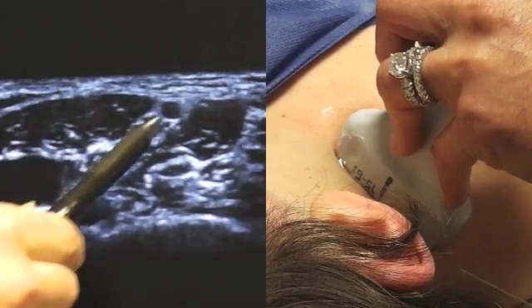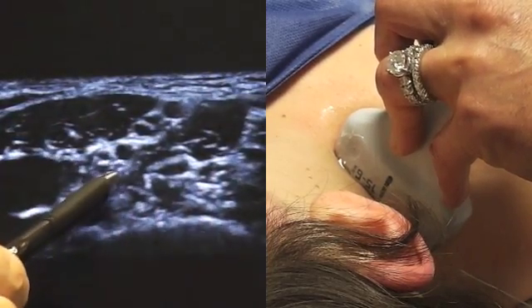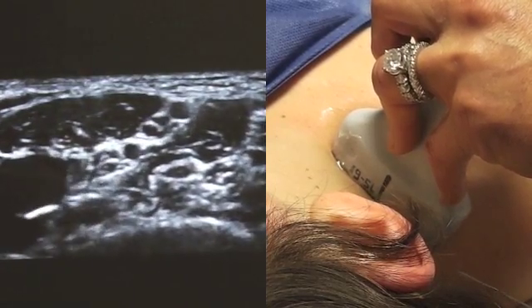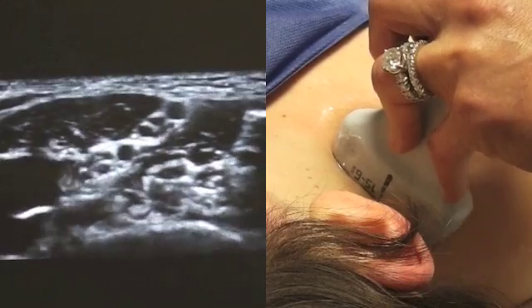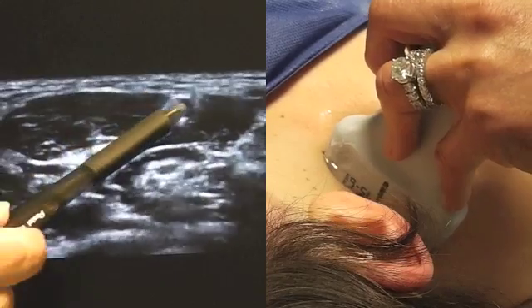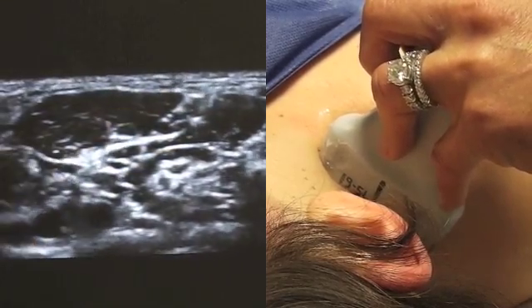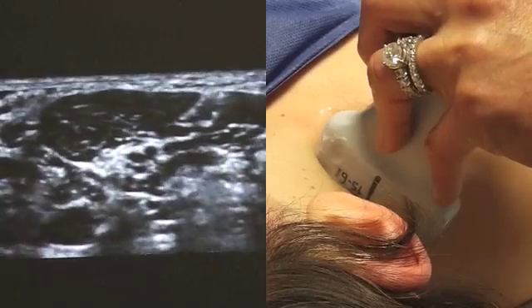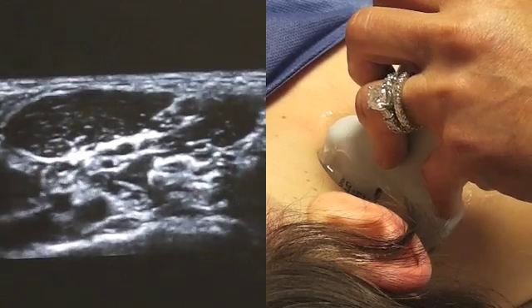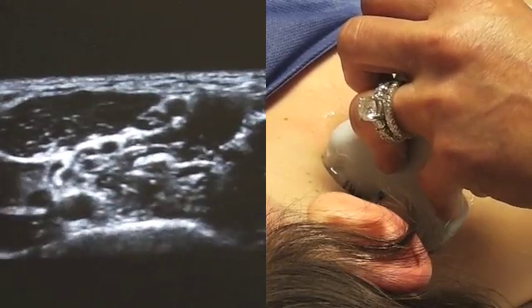Once the needle is inserted, we typically inject deep to the plexus 15 mLs of half percent ropivacaine. Once we see good spread of local anesthetic, we withdraw the needle and then place it more superficially towards the superficial aspect of the plexus, where we place another 15 mLs of half percent ropivacaine. Once all the local anesthetic is administered, we either remove the needle if it's a single-shot block, or we place a catheter.